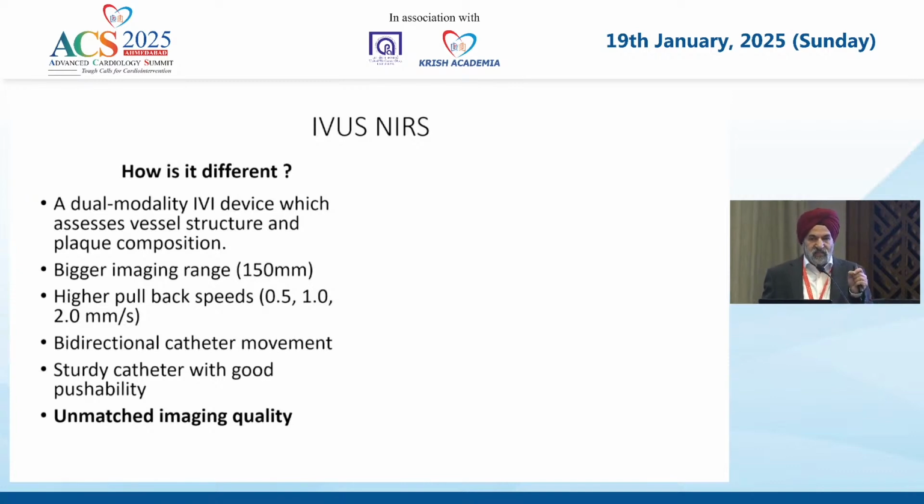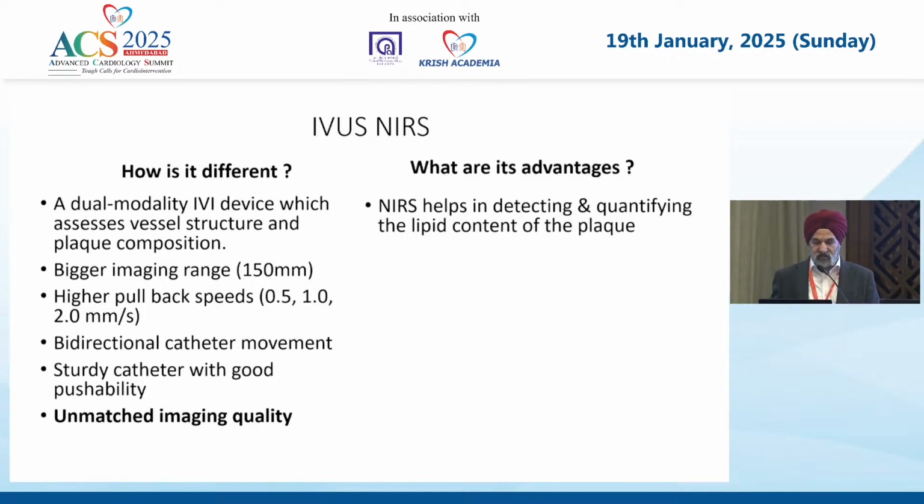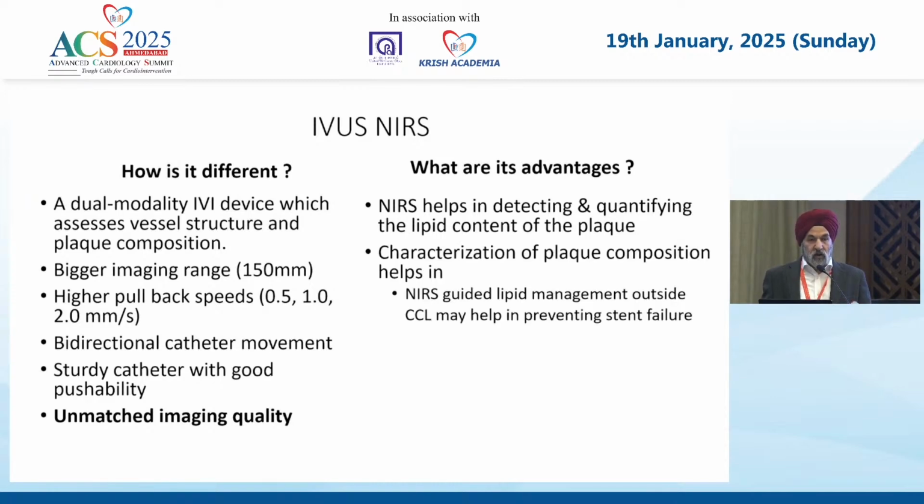These are pictures which, at times when I've gone around centers, people have said look like black and white OCT. Very nice images. The advantage is you have a co-registered NIRS available which tells you about the plaque composition. It not only picks up the lipid but also quantifies it. And how does it help? It takes the prescription out of the lab to the OPD.